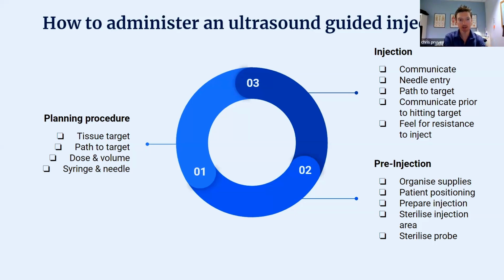so how thick they are. I don't know whether you can see that, but the green needle is thicker than the blue needle. And this makes a difference when you're injecting certain tissues. So we've got a really thin needle, which is great. These 27 gauges are used in dentistry a lot, but it's very, very weak. So if you're going through tissues, sometimes it bends, and you can't get it through.